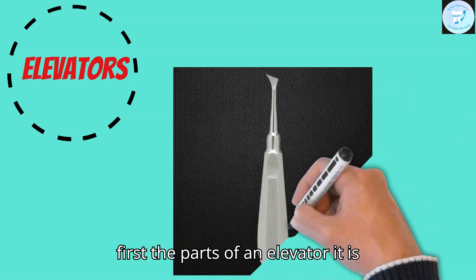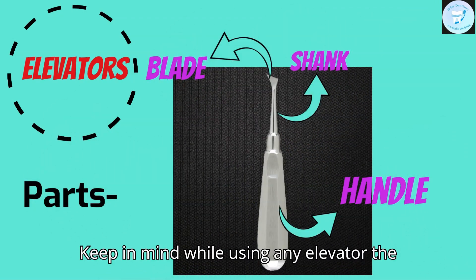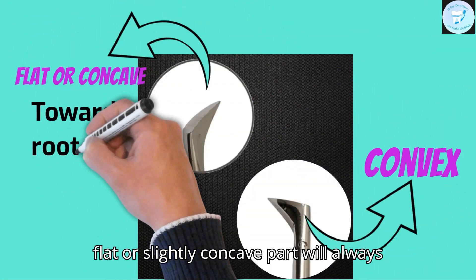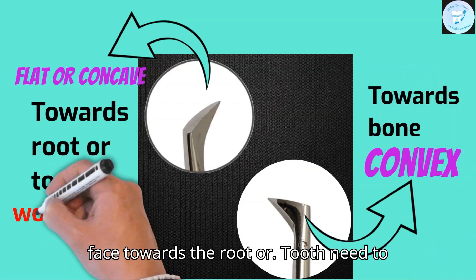First, the parts of an elevator: it has a blade, shank, and handle. Keep in mind, while using any elevator, the convex part will face the bone and the flat or slightly concave part will always face towards the root or tooth to be elevated.